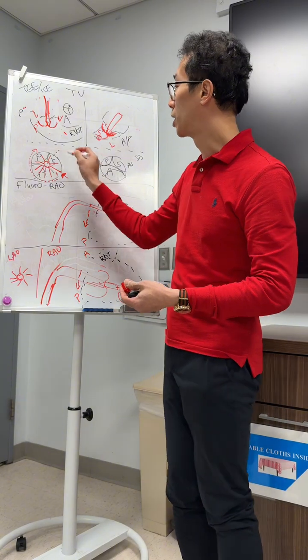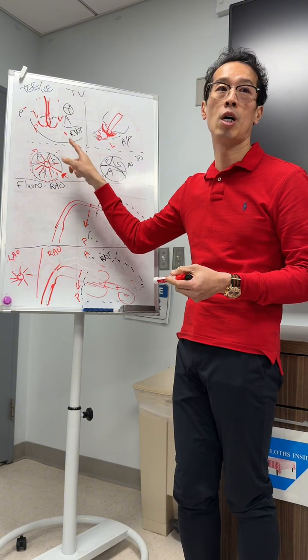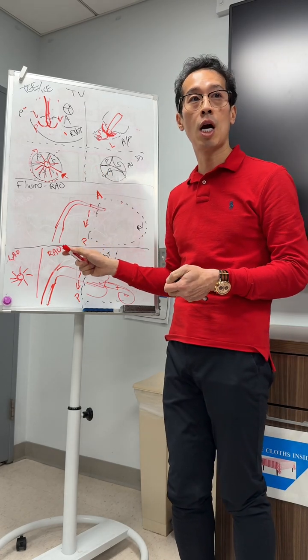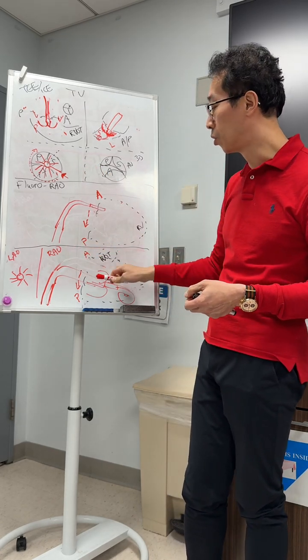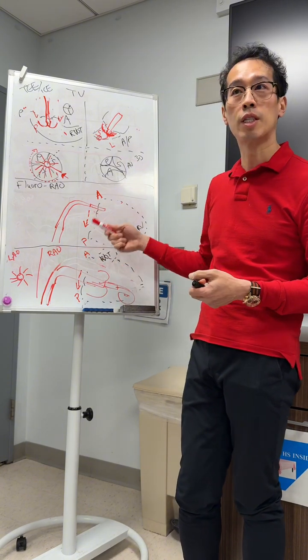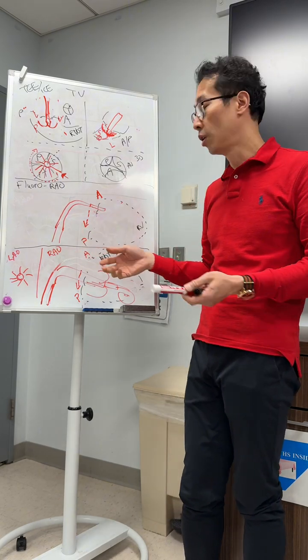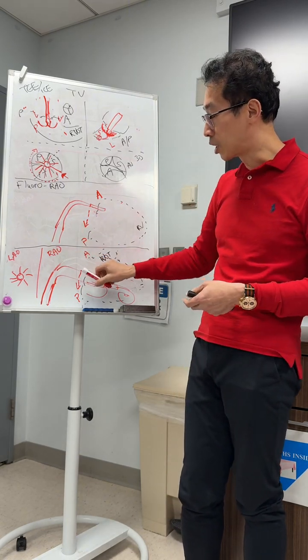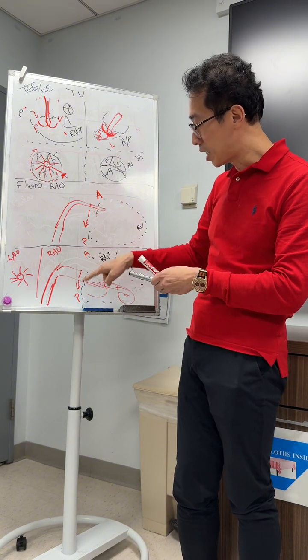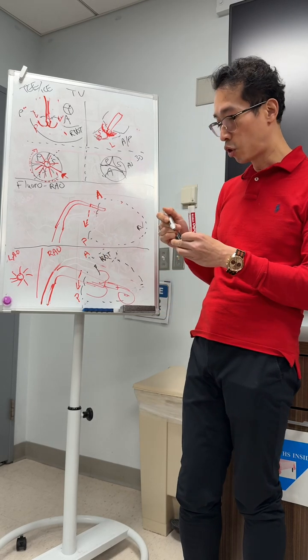Okay, so this is a very important point in terms of how you image on your MPR to confirm leaflet capture. Now, the other thing with the TTVR that's important is that if you need to, now your anchors are flipped and you need to get some more, remember it's not as flexible. So now you need to adjust. If you want to go here, right, this is A and P. If you need to go more A, right, there are 2 ways to do this.